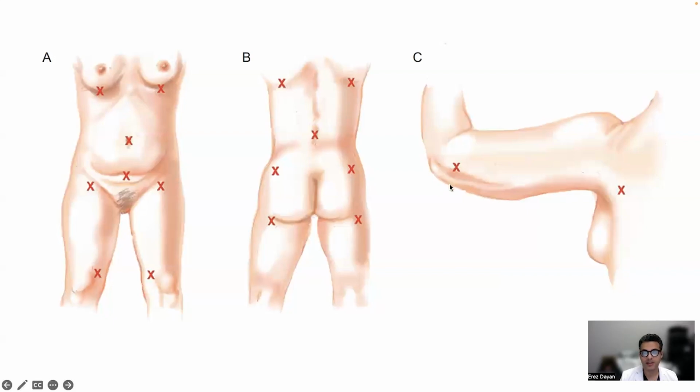For the arms, we typically like to make an access point just proximal to the elbow, about two finger breadths, so you're avoiding the ulnar nerve, which is superficial there, and then you can liposuction the arm almost 270 degrees using that one access point.